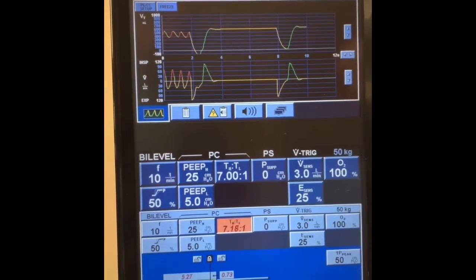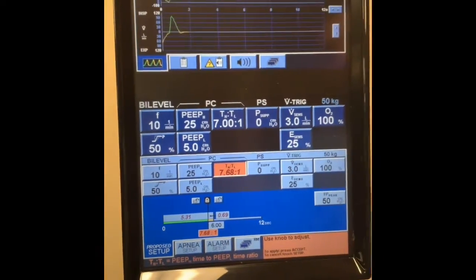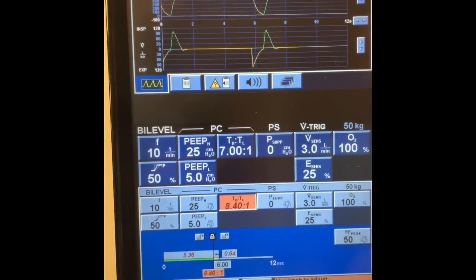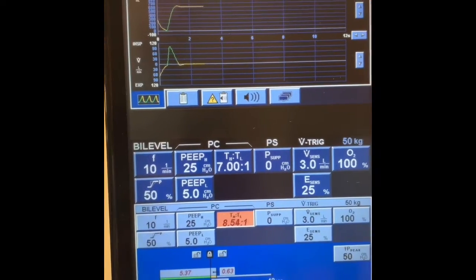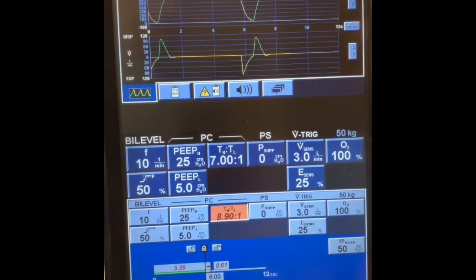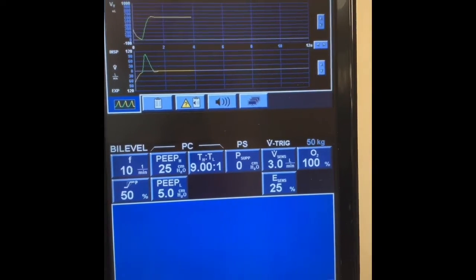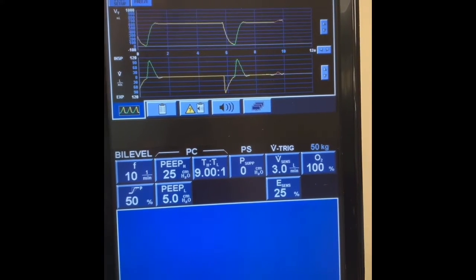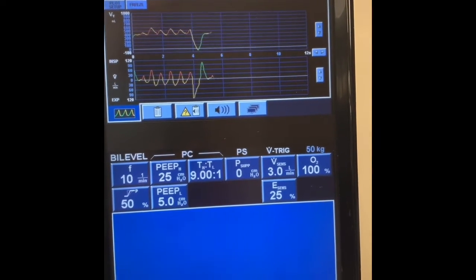You can keep going with the IE ratio as long as the patient is hemodynamically stable. I've had it as high as 10 to 1; you can go 11 to 1, but at that point you really have to watch hemodynamics. If the lungs are stiff, watch out for pneumothorax because your mean airway pressure will tremendously increase. We started out at 23 and at 9 to 1 the mean airway pressure is much higher. The whole point is to try to oxygenate through increased mean airway pressure, but at a certain point you reach where you're defeating the purpose.